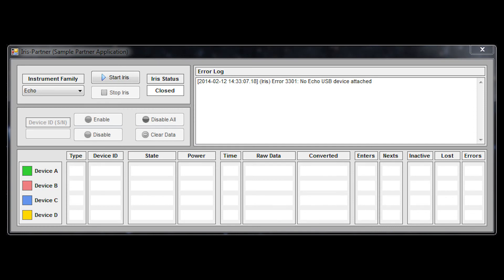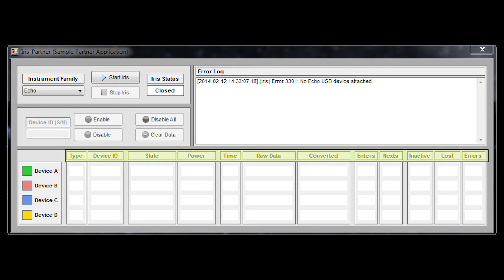We also provide an example program that was created by JTEC software development to give you an example of how you can create your own custom software and use the API to interface with the hardware devices as well. In the sample program you can see that we allow an enable feature, disable feature, and a few standard components for seeing the output from the device in real time. But with a little bit of creativity and fitting your application to the IRIS software, you can basically do anything that you need to.